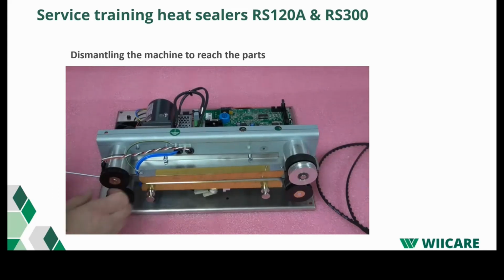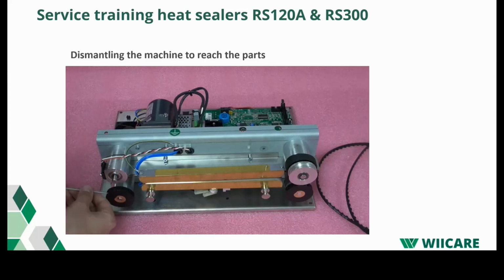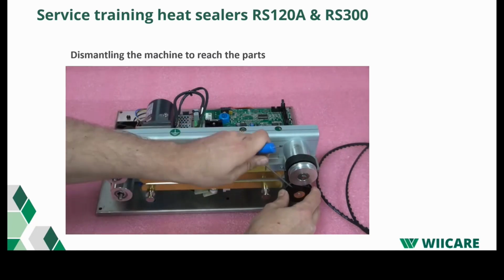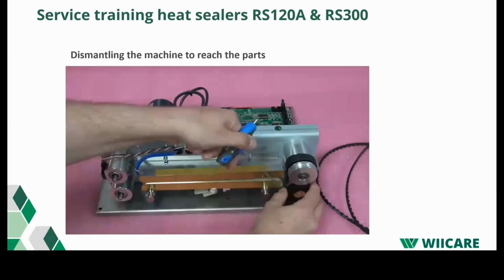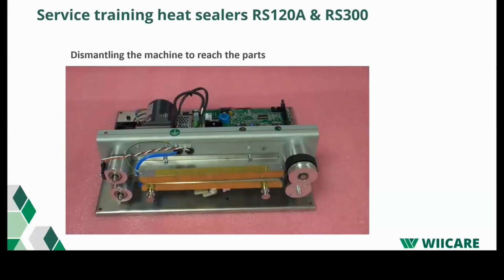Normally disassembling the pulleys is not really necessary, but in this video we just added it so you can see it. Of course you disassemble them if you want to replace them. Unscrew the earth cable.